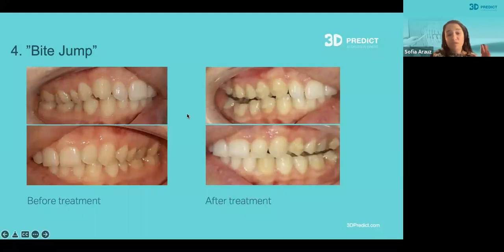We are moving teeth. We are not dealing with muscles. No aligner company knows how the mandible is gonna end up. And thus it is very difficult to give you a 100% accurate treatment plan. In that case, refinements are usually needed, but it doesn't have to be this amount of open bite if we actually plan it much better from the beginning.